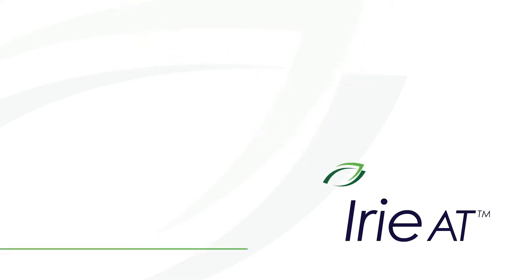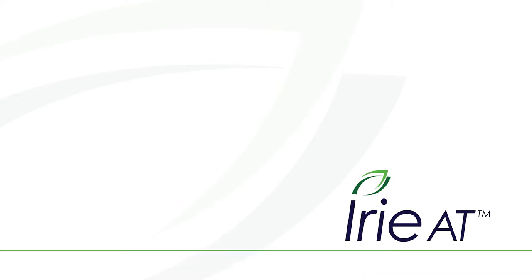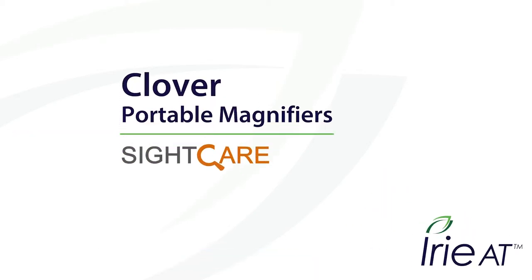Welcome to Irie AT, where you'll always find the best in Braille and Low Vision products. Today's focus is on the Clover Portable Video Magnifiers from SightCare.